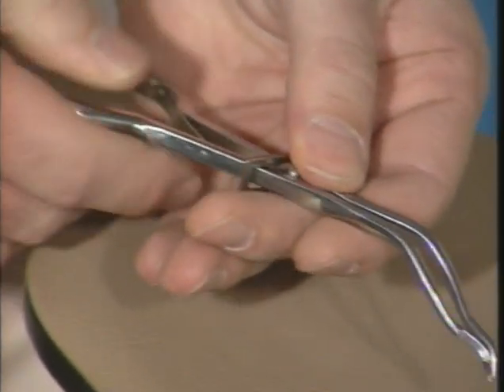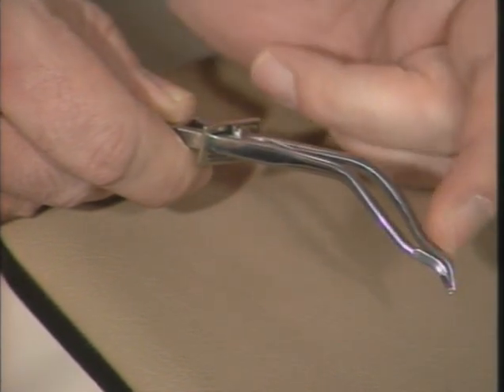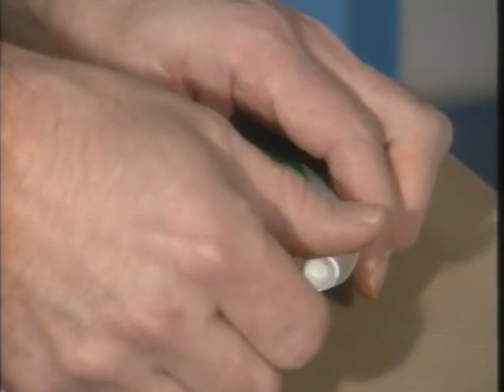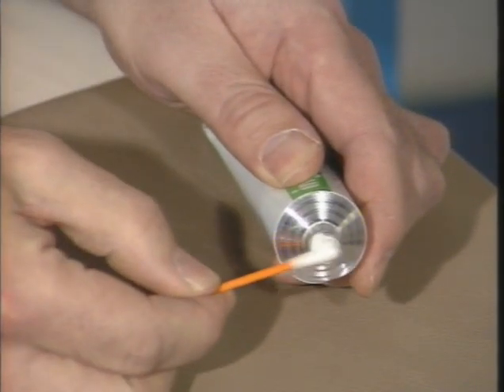It's very important with these that the jaws themselves are correctly shaped so that they do retain the clamp and so that they give you an avoidance of tilted teeth or teeth which are in a bad position. Once the clamp has been placed on the tooth, then the dam is carried to the mouth, it is passed around that clamp and between the interproximal areas of all the teeth which are going to be involved in this rubber dam placement. Sometimes getting the rubber dam through the contacts can be a little bit difficult, and therefore before doing this it's probably best to lubricate the dam using something like a brushless shaving cream. Being water soluble, it will wash away from the field of the operation without leaving any contamination.